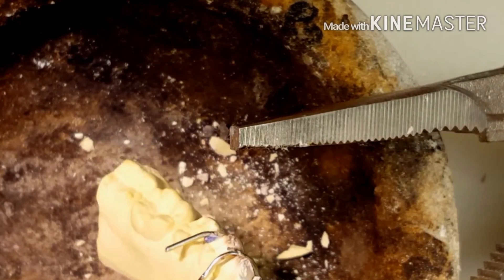Once the solder joint flows, you can evenly manipulate the solder.